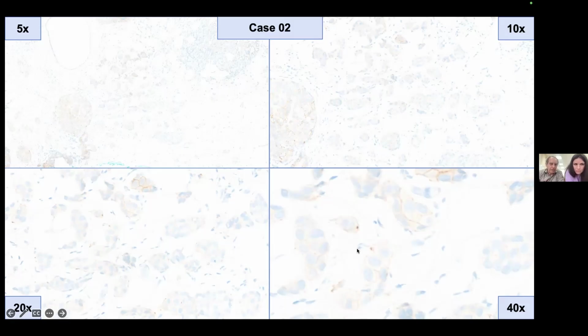So Ade, what do you think of this diagnosis? Yeah, so again, low power, that might be in situ where I see a little bit of membrane staining. And then I start to see a few clusters at 10 maybe magnification. But not really, I can't see membrane staining here. But you can see it here at ×20. Yeah, it's kind of weak to moderate. This is 20 on the lower left. I think this is more like moderate, but then we see quite a bit of weak. I'm starting to wonder if it's discontinuous, with a little bit of cytoplasmic staining perhaps as well.